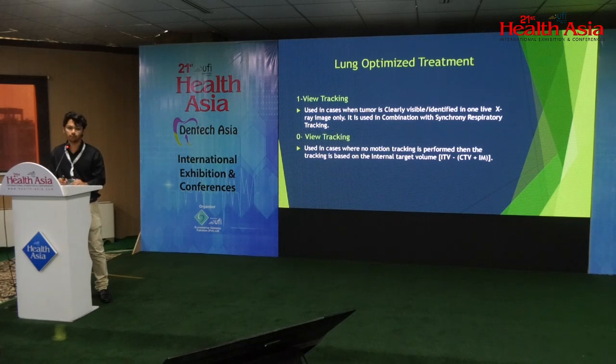So we have to make sure that the patient's respiration is completely recorded and the patient is completely aligned according to the parameters. And as long as that is performed, we are confident the patient is being treated accurately.